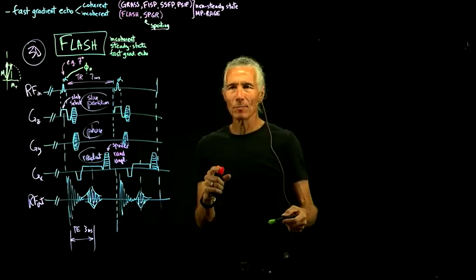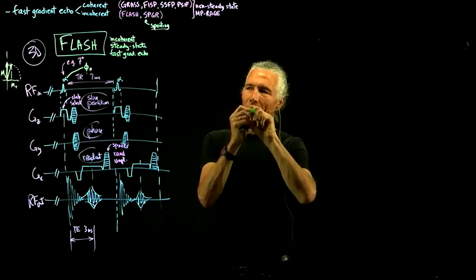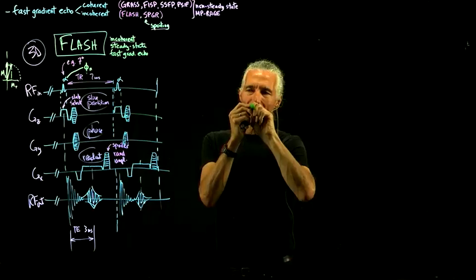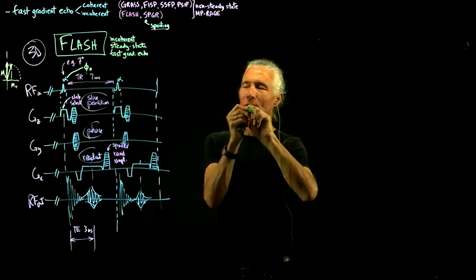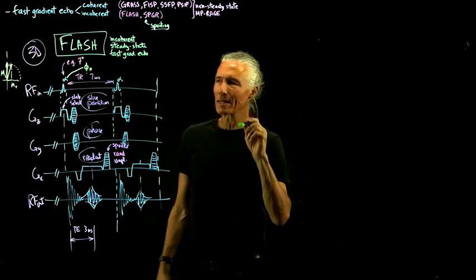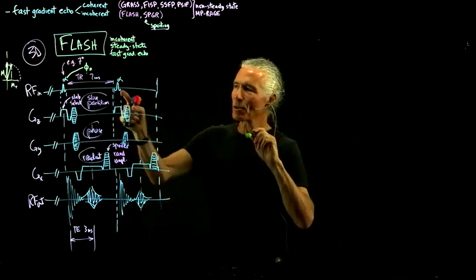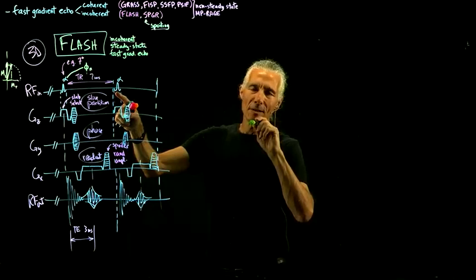So when you turn the transmitter on, the transmitter will say, I'm going to start with the magnetization of this 123 megahertz signal pointing in that direction at time t equals 0. And then the transmitter keeps really good time, and so you can say, I'm going to turn on this RF pulse with a phase of 90 degrees. What does that mean?